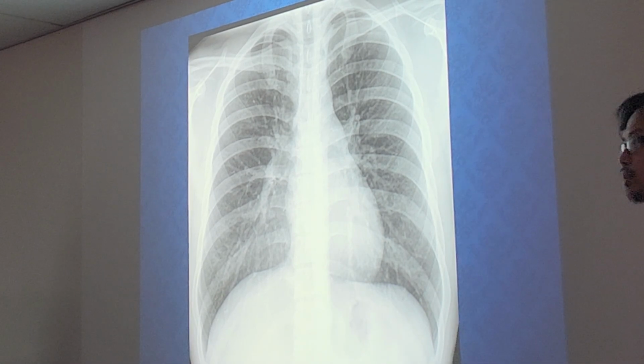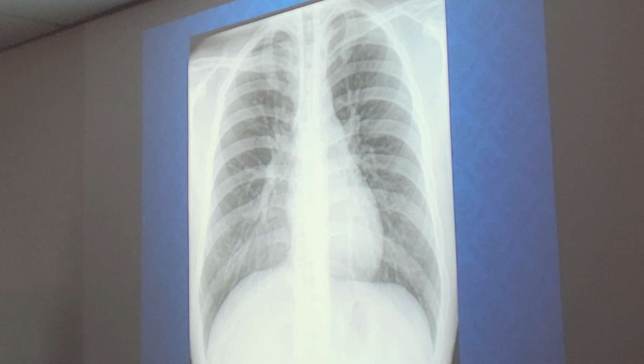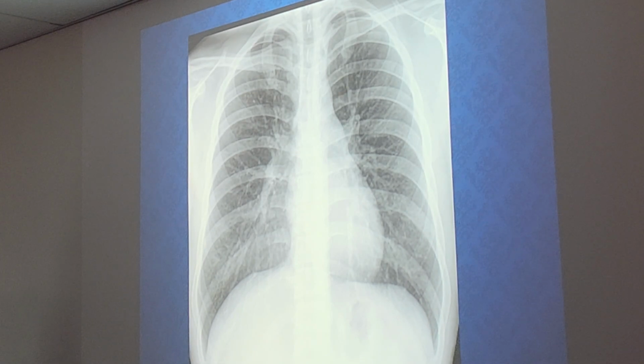Also, Ms. Bonilla mentioned soft tissue, the heart. How does the heart differ between AP and PA? Is it magnified? Yes, because of OID. On APs, the heart tends to look a little bit more magnified than on the PA. Okay, any confusion with the AP PAs? That's the best. Thank you, Mr. Fong. Thank you, Mr. Khan.